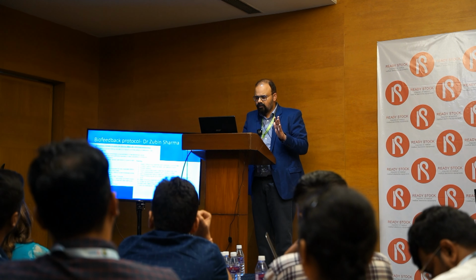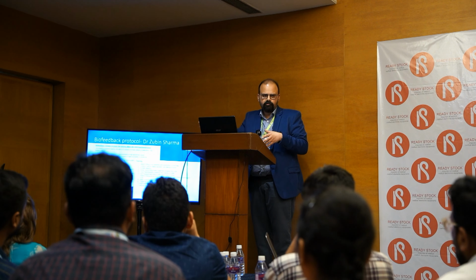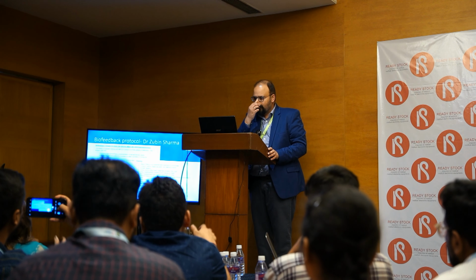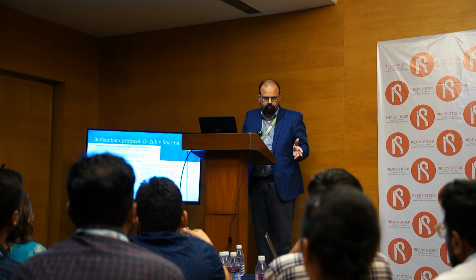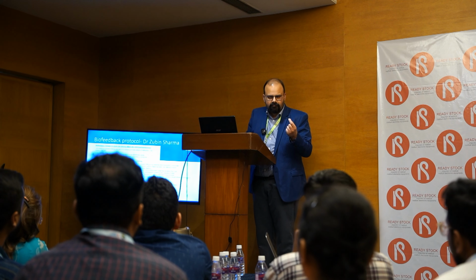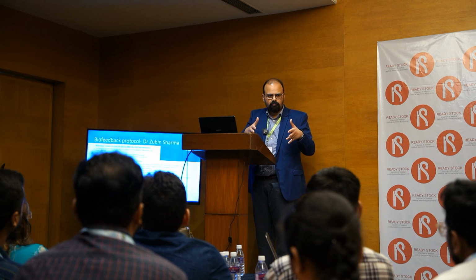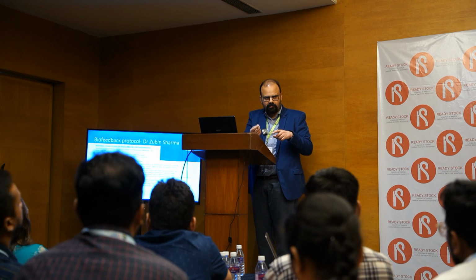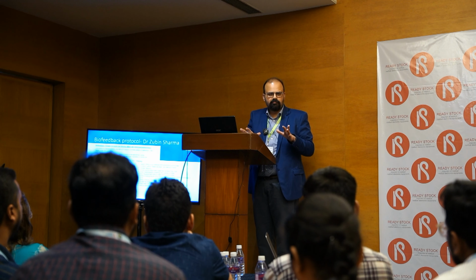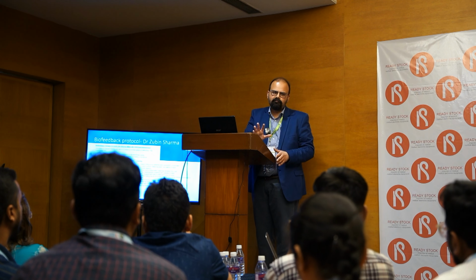So then you actually start the true session. I'll show you the video in the end of how it looks on the screen in the software itself. I do it in the left lateral position. More physiological is obviously the commode, but it's difficult to pass the catheter, though you can have a customized commode where it becomes easy to put in. But in daily practice, it's easier for both the patient and you to do it in the left lateral position.